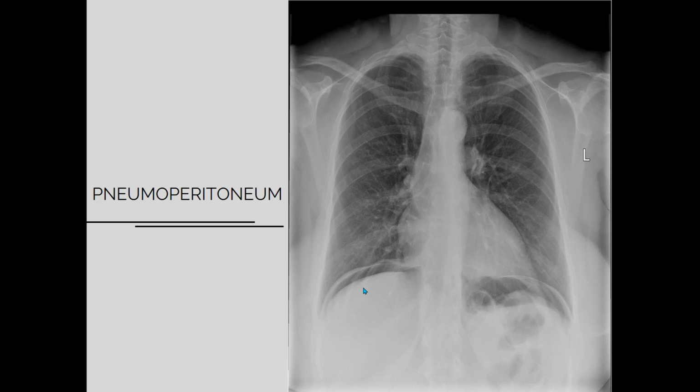And why is there pneumoperitoneum? Not only visceral perforation, but for example, if there was any laparoscopic procedure or hysteroscopic procedure, there may be air that may remain 1 week or 10 days, okay. So that shows that whenever you have to diagnose pneumoperitoneum or any visceral perforation, you should ask for the X-ray chest, not X-ray abdomen, okay.